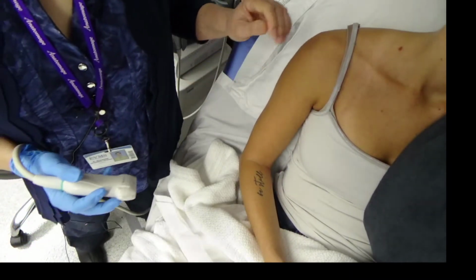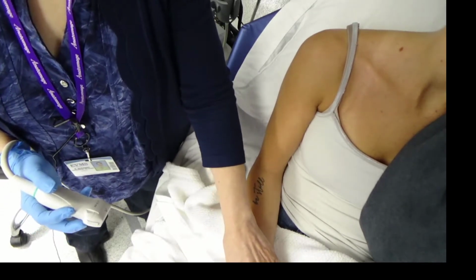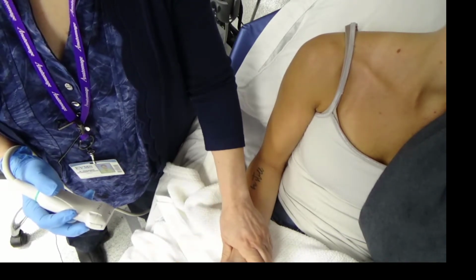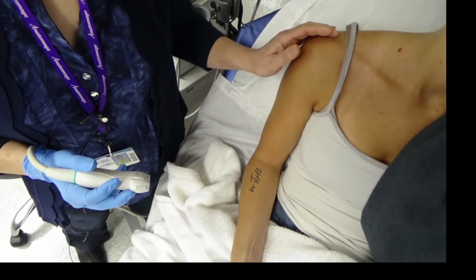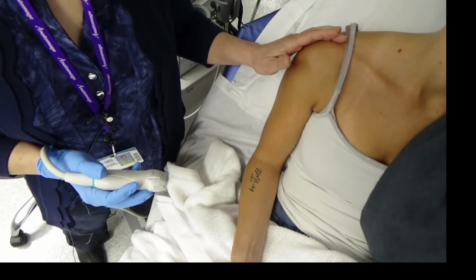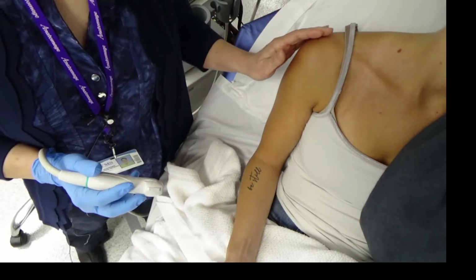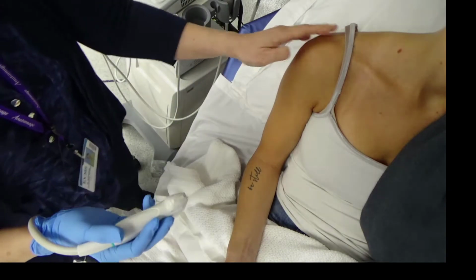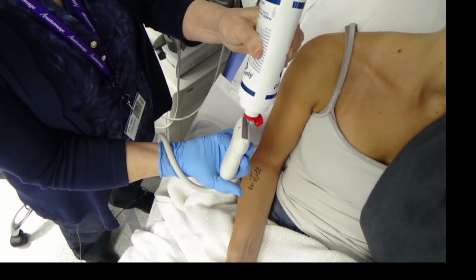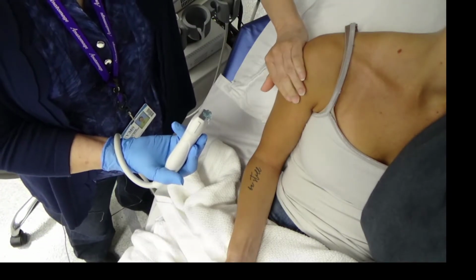So what you'll want to do with your patient is you're going to want their hand to be in a neutral position, which means the palm is going to be up, and you may make some minor adjustments inward and outward depending on the patient's shoulder. That's going to largely depend on the size of the shoulder. We have a relatively smaller shoulder here, so we might have to make some adjustments to line up whatever we're looking at. But in just looking at the deltoid, I'm just going to put a little gel on my probe. And we know the deltoid is making that cap.